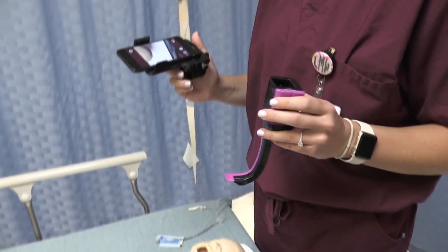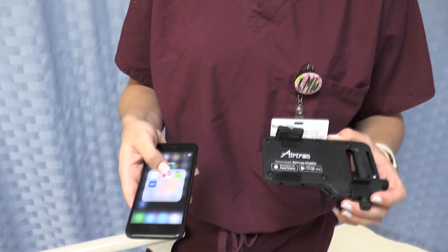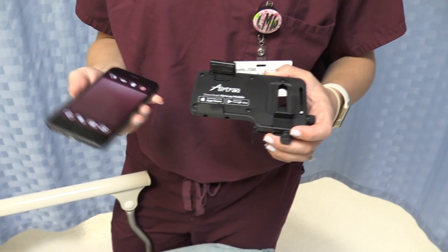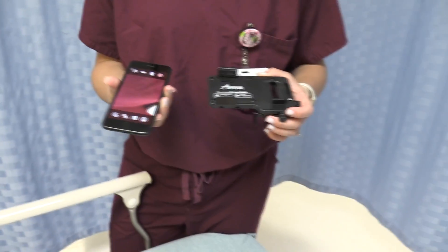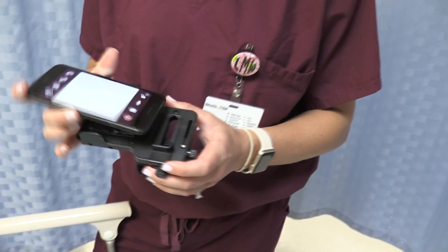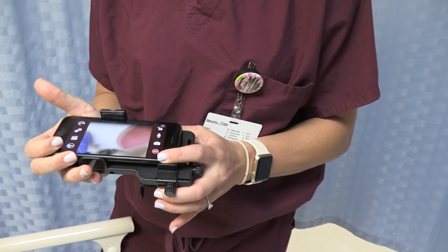Go ahead now and show us how to set this up. We're going to click the AirTrack mobile app, which you can download from the internet. Now we can see the camera screen. You have to place the camera towards the white dot on the AirTrack device.